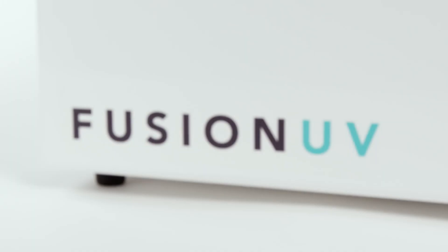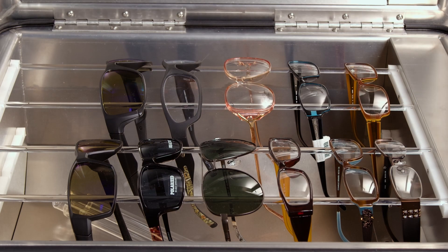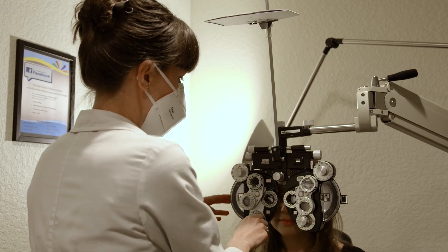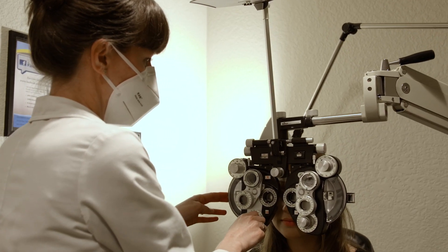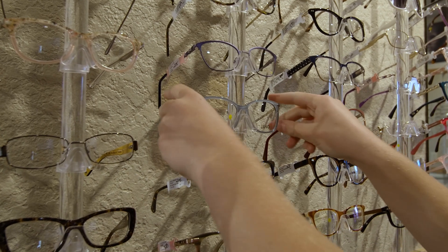The Fusion UV is contained in one lightweight unit and can disinfect up to 12 frames in under two minutes. ECPs can also sterilize N95 masks, keeping them effective up to seven uses, and can disinfect small tools and equipment.